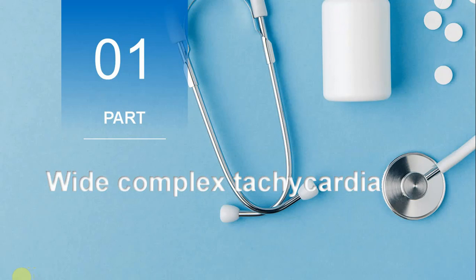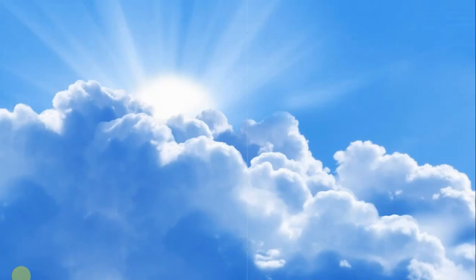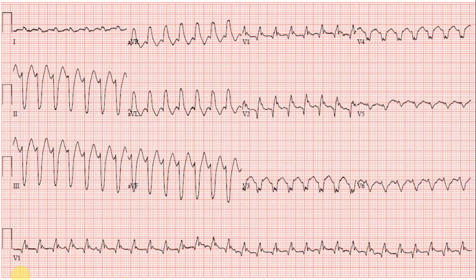Let me show you an ECG from a patient we saw a few months ago — a 72-year-old who came in with palpitations. As you can see, there are wide QRS complexes that are pretty regular, with a ventricular rate of about 200 beats per minute and a right bundle branch block appearance. We diagnosed this patient with VT and treated accordingly; the patient ended up having a pacemaker/AICD and is doing well.